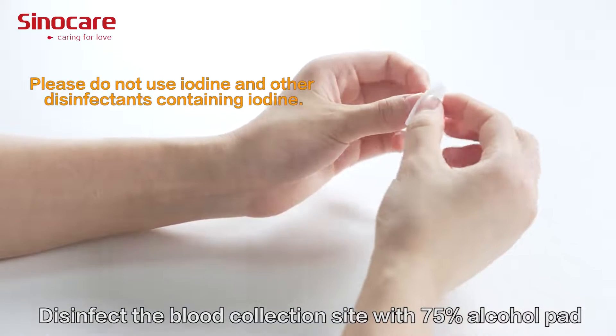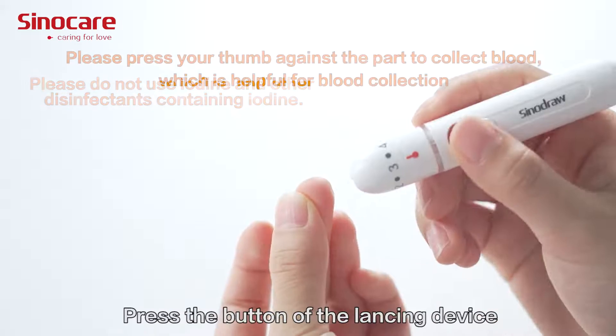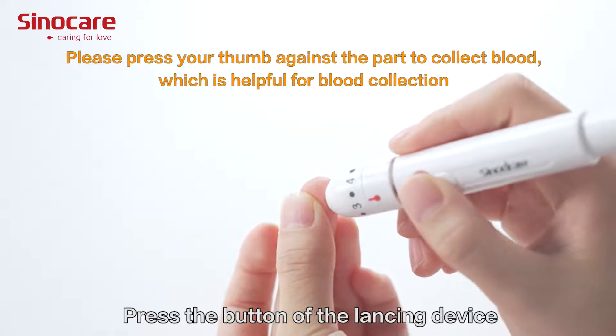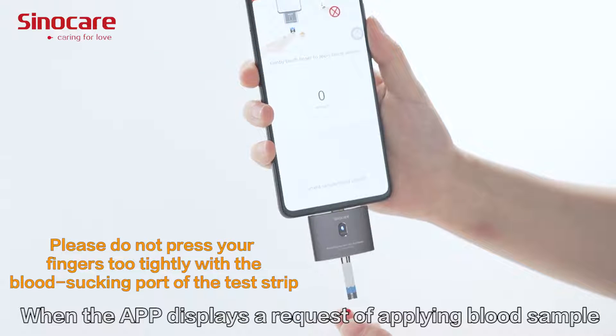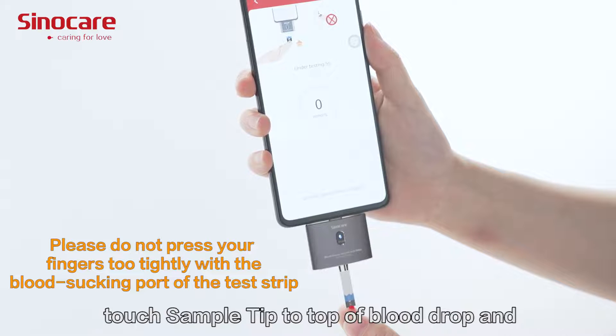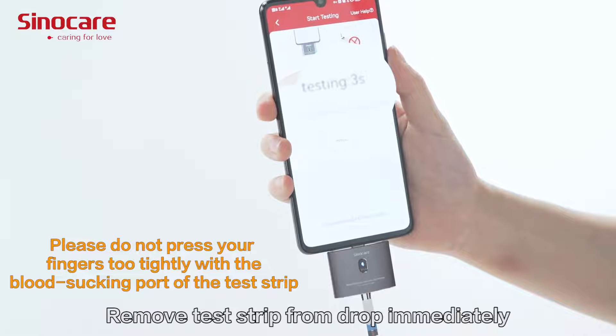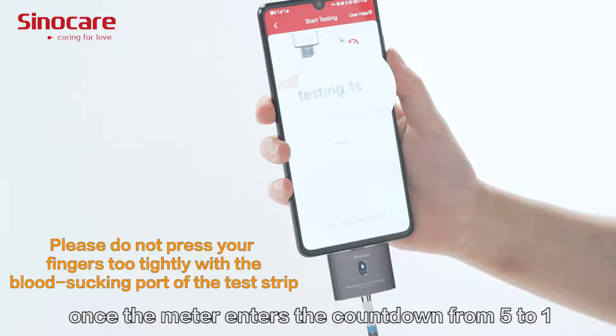Insert the test strip into the test strip port on the meter. Disinfect the blood collection site with a 75% alcohol pad. Press the button on the lancing device. When the app displays a request to apply a blood sample, touch the sample tip to the blood drop and allow blood to be drawn into the test strip.